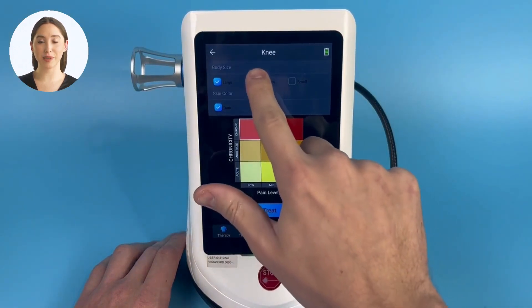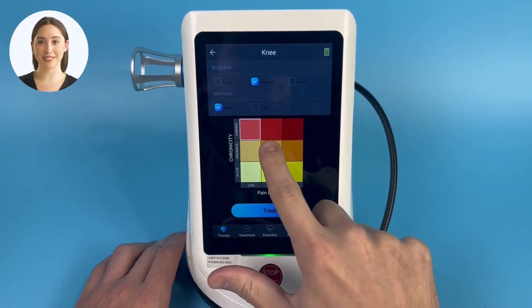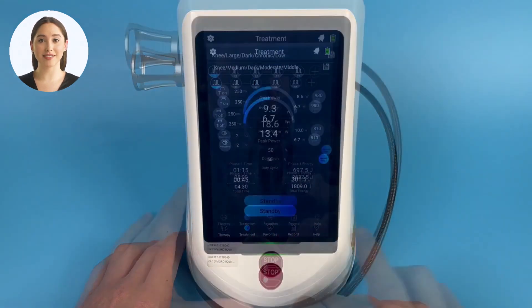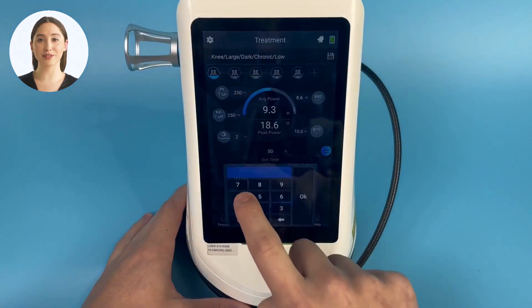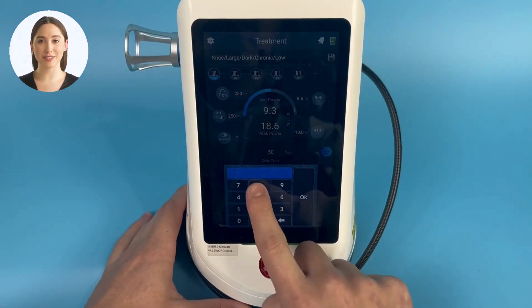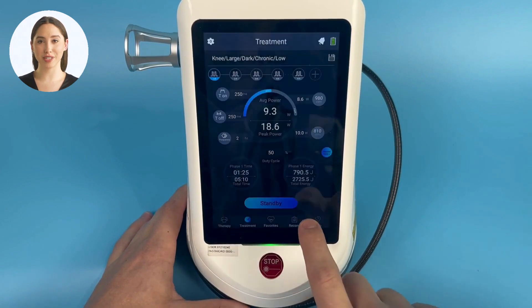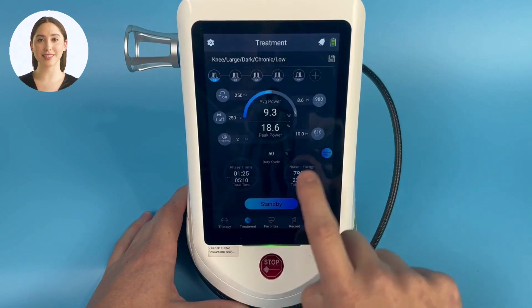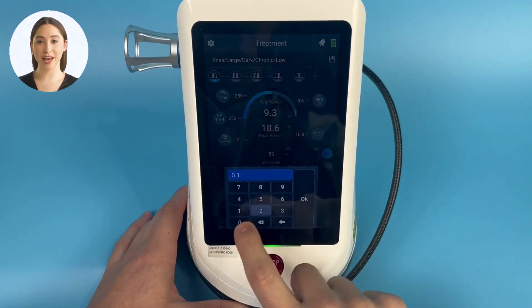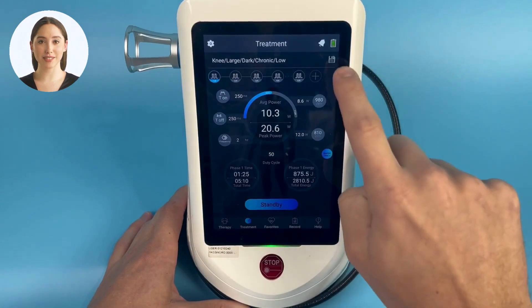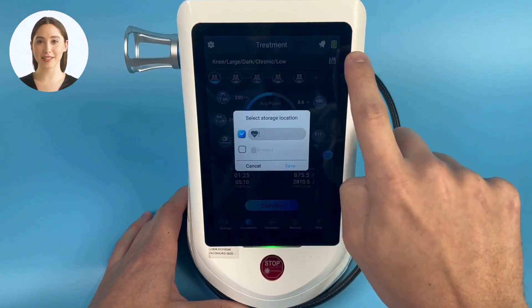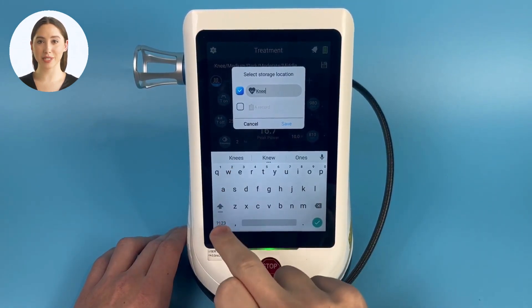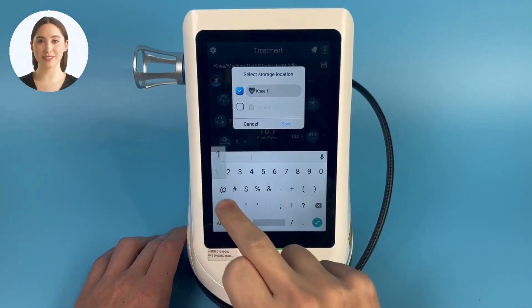Let's edit an internal protocol and save it to our favorites. Start by selecting therapy — for now we will use a knee treatment. Input the patient's correct body size, skin color, and chronicity, then hit treat. For this treatment, I want to increase the phase one time and also turn up the power for the 810nm wavelength. To do this and any other changes, simply tap on the parameter you'd like to adjust and input the new value. Once satisfied with this protocol, I will save it by clicking the floppy disk icon located in the top right of the screen just under the battery sign. I will name this newly made protocol 'knee one' and it will save to my favorites.